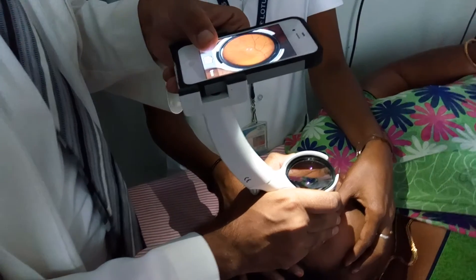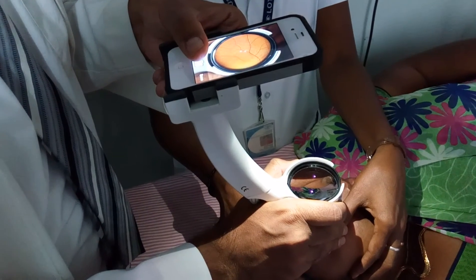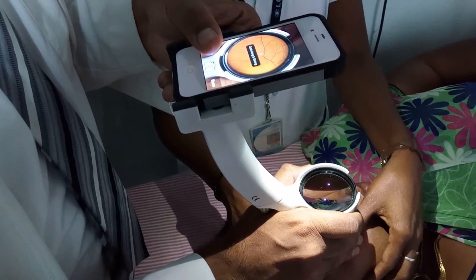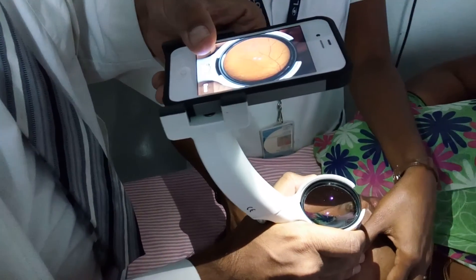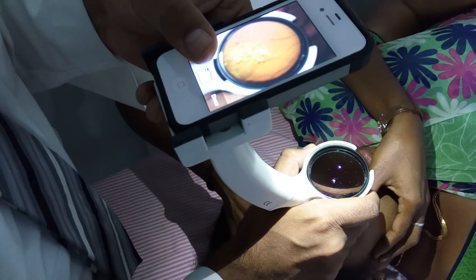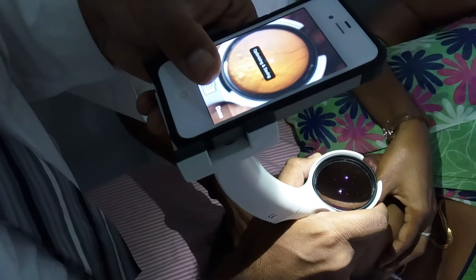My fingers are giving me support, and with the help of my other hand I can keep clicking pictures. I can ask the patient to look down so we can see the inferior quadrant. You can visualize the old resolving vitreous hemorrhage here, and we click the picture.